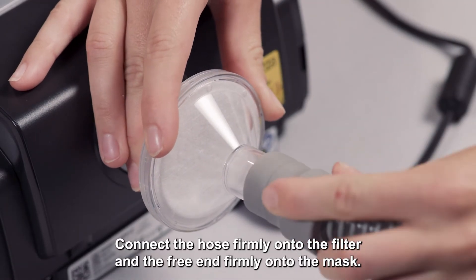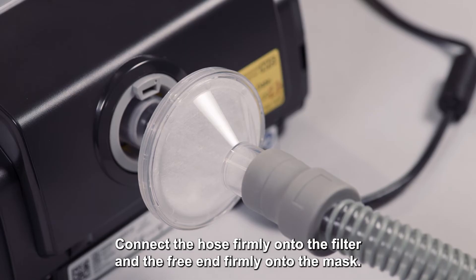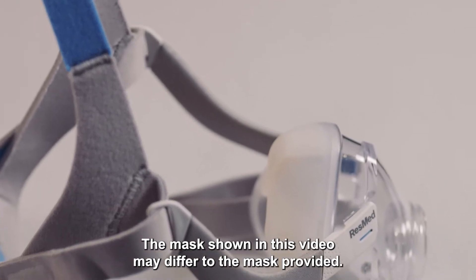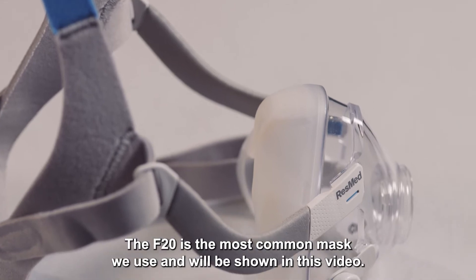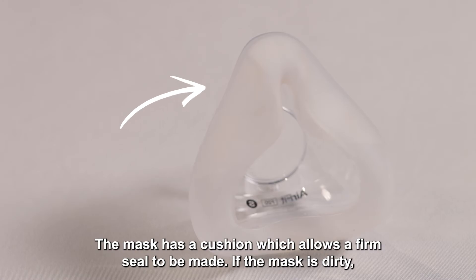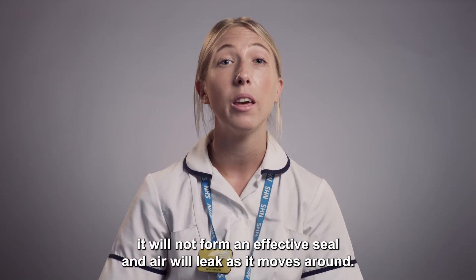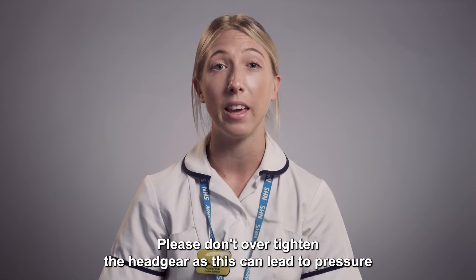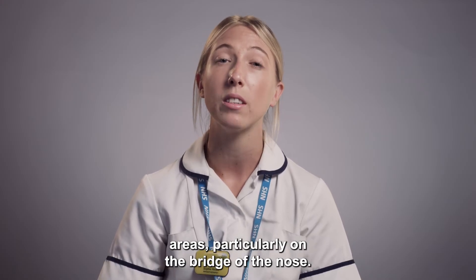Connect the hose firmly onto the filter and the free end firmly onto the mask. The mask shown in this video may differ to the mask provided. The F20 is the most common mask we use and will be shown in this video. The mask has a cushion which allows a firm seal to be made. If the mask is dirty, it will not form an effective seal and air will leak as it moves around. Please don't over-tighten the headgear as this can lead to pressure areas, particularly on the bridge of the nose.